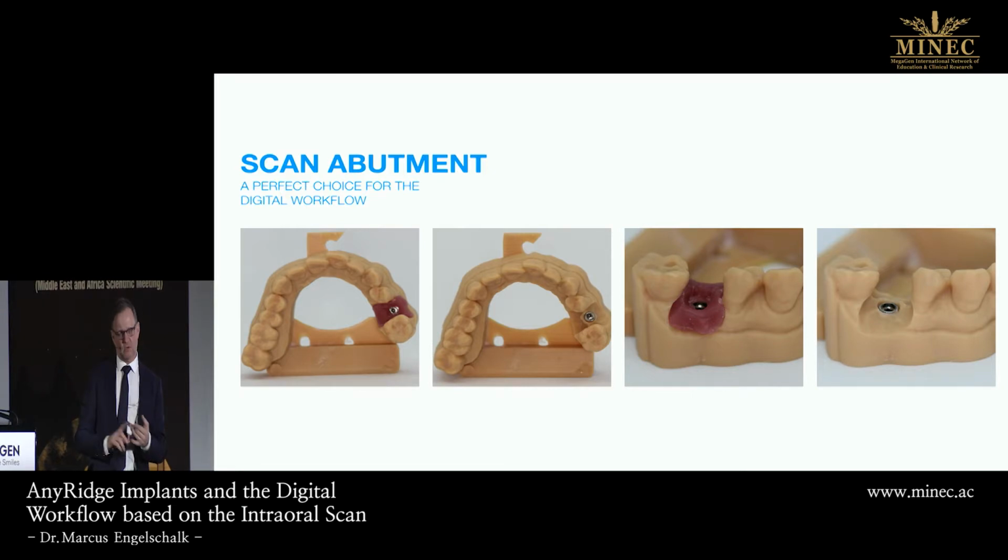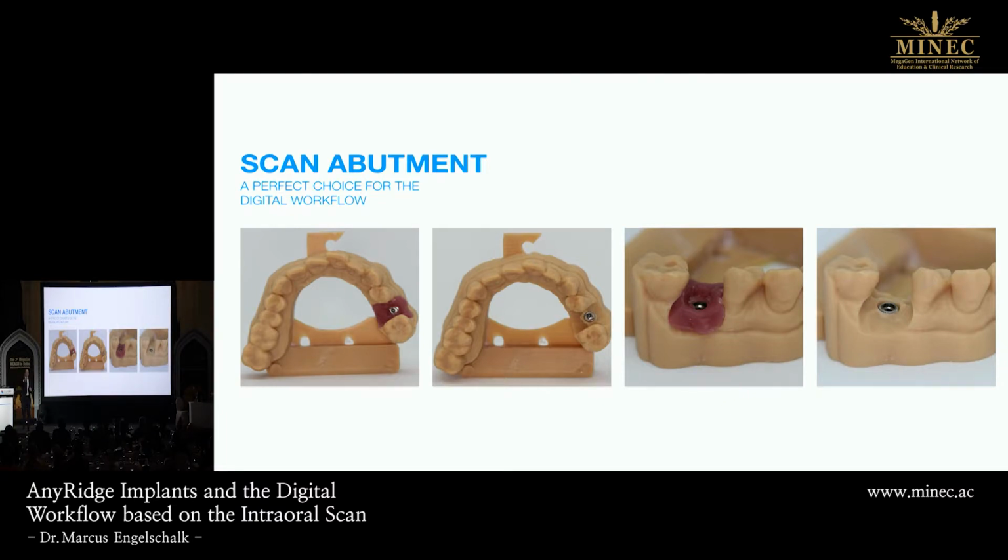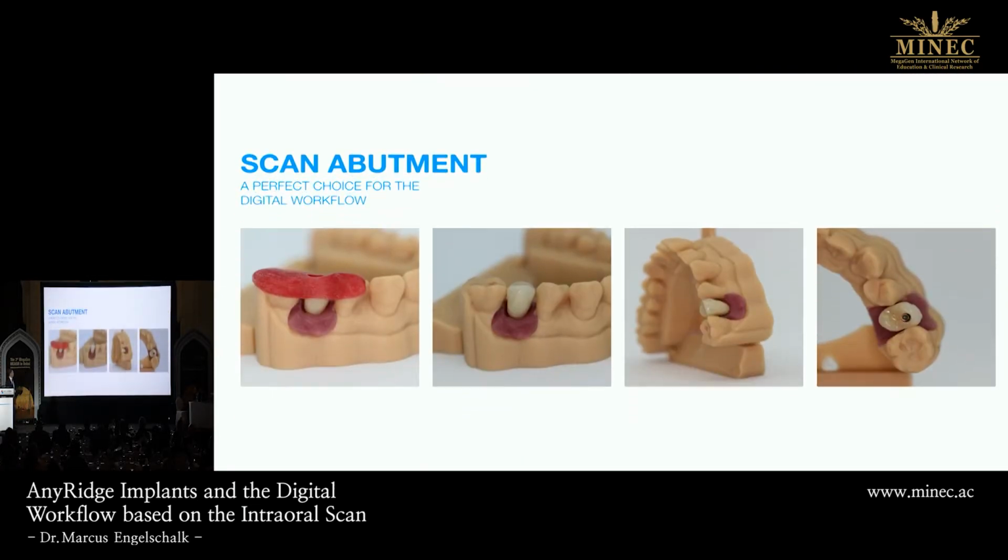without any model. Because the secret behind the model factoring is, do you have a lab analog for your printed model for your implant system or not? But not everything can be done milled without any model, model-free. That's not possible. But not every model which can be printed or milled can keep a lab analog. That's very important to know. So now we can use, today there are some companies producing these models, and you see it's like your normal cast you're using. And you can produce everything you need like you do it in your regular daily business.